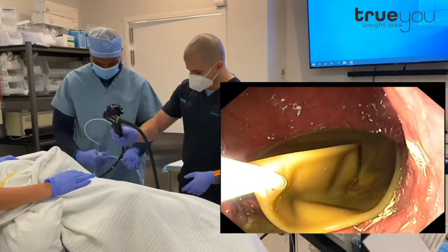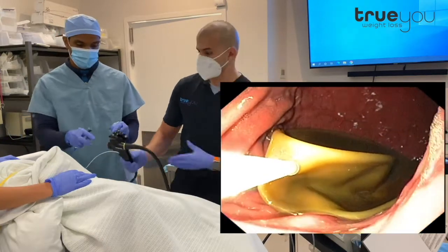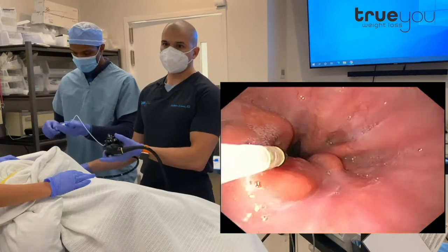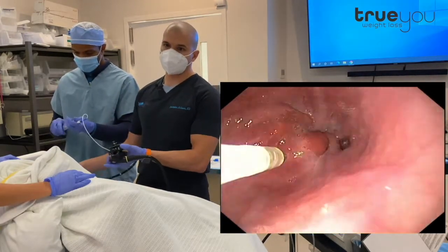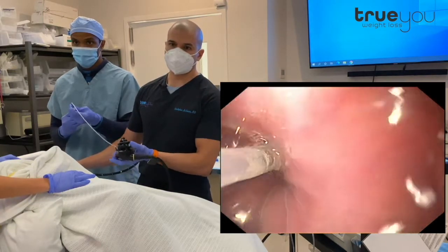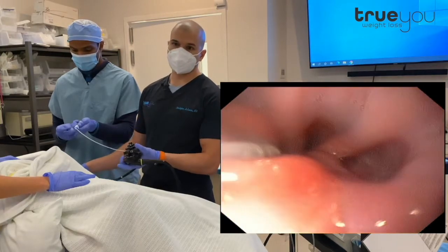Lubricating the esophagus is another little trick that will help the balloon come right out very easily. We're going to take a little bit of mineral oil and spray it right through here into the esophagus. That balloon can be a little bit sticky as we're pulling it out through the esophagus, so this just ensures that it slides right out. We're spraying in just a small amount — a few cc's of mineral oil — and then we'll follow that with a tiny bit of air just to push the rest through.